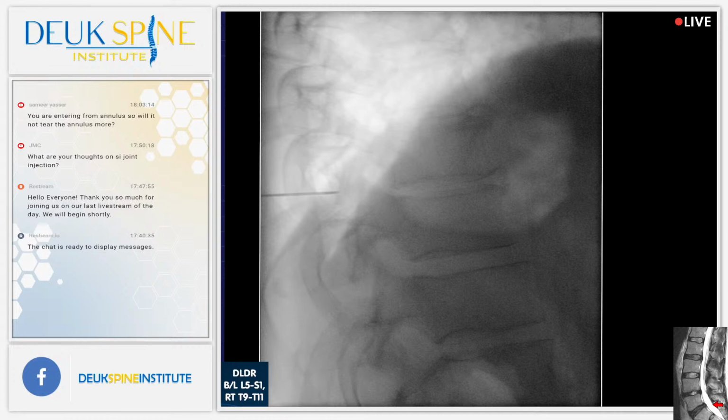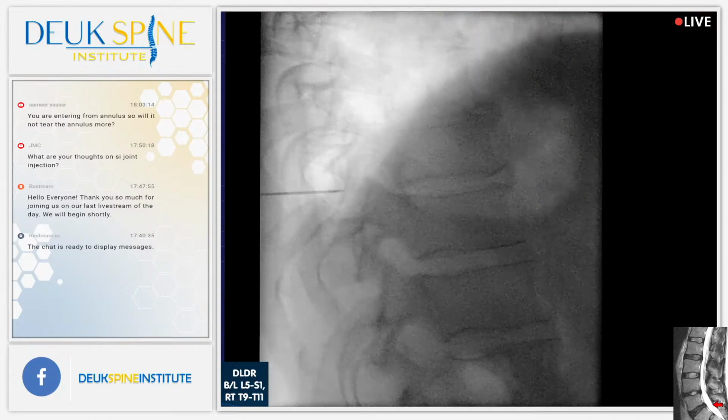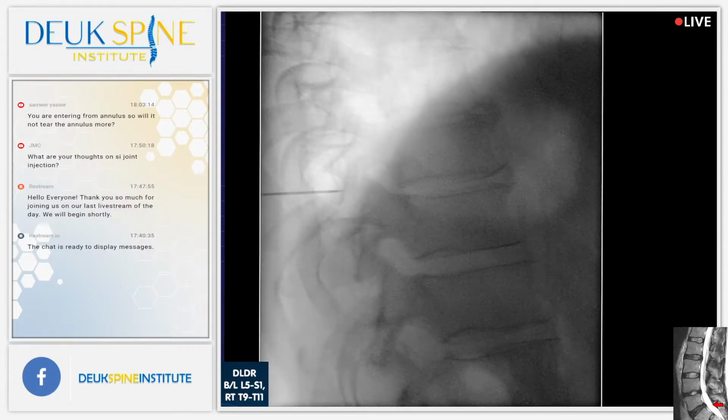Yeah, I'm too medial. You're watching, folks, and you're getting the surgeon's thoughts as I navigate. So you're getting to hear everything I'm thinking about and analyzing from an experienced endoscopic spine surgeon. Okay, I could probably be a little bit more lateral.